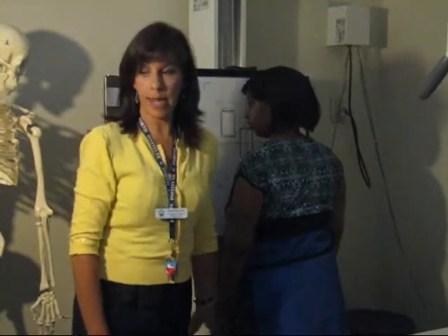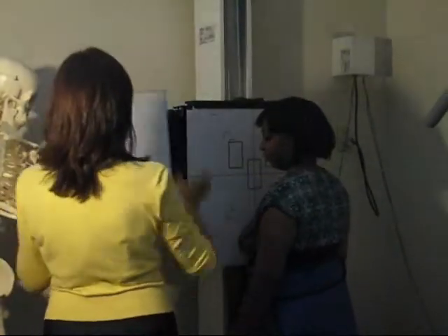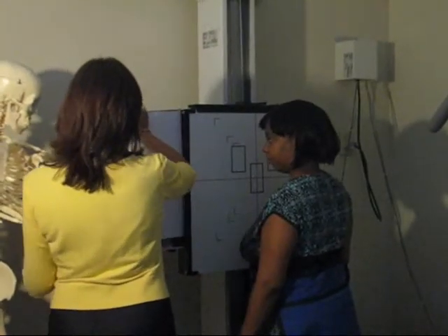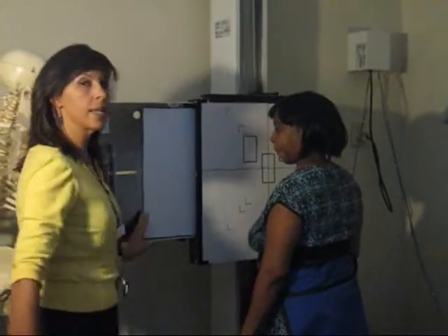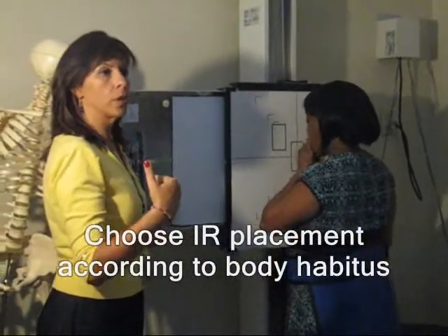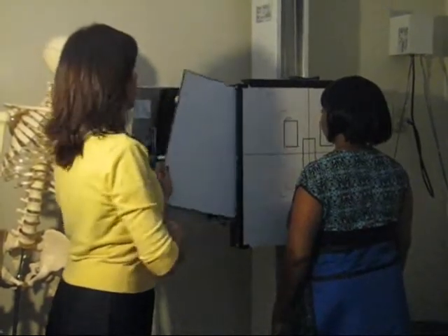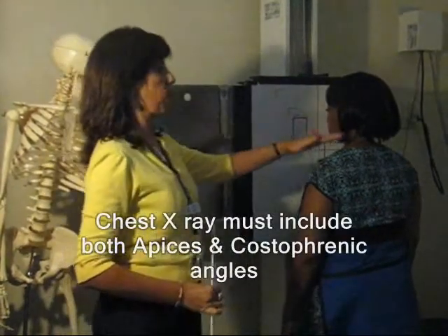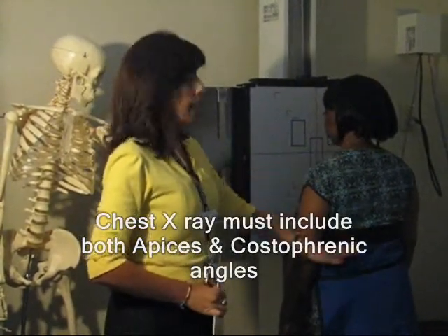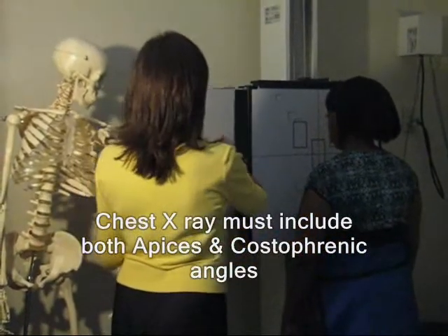Okay. And we're going to choose the right size cassette, which in this case, for most people, you can use a 14 by 17 lengthwise. Some people who have short trunks and larger chests, you may turn the cassette crosswise because you want to make sure that you get both the apices and the costophrenic angles, and that you don't cut out any body part. Okay?